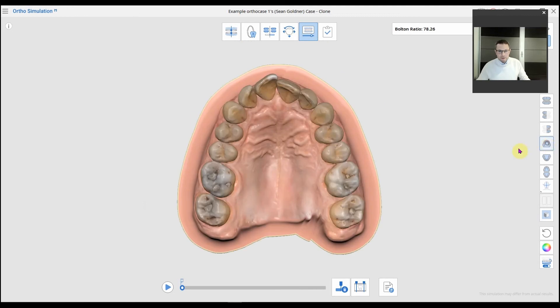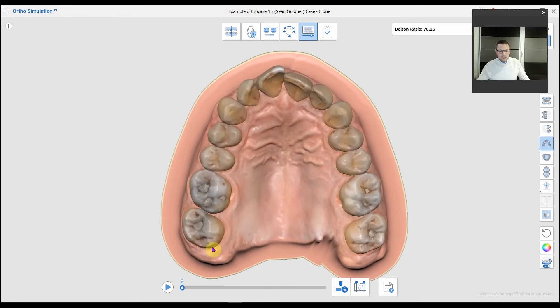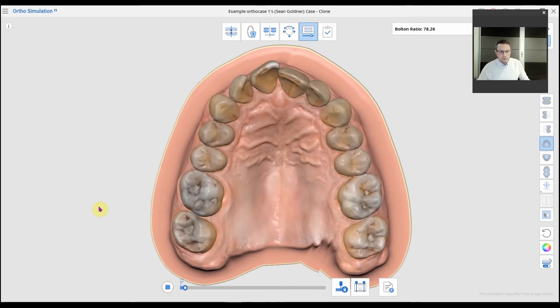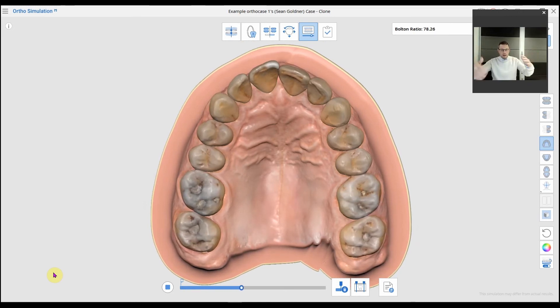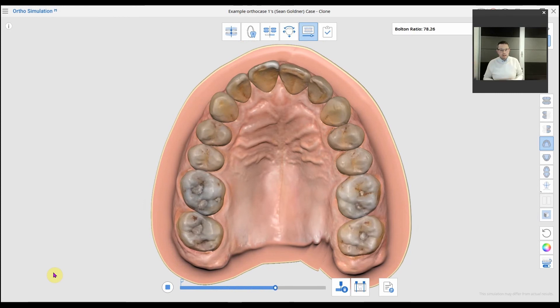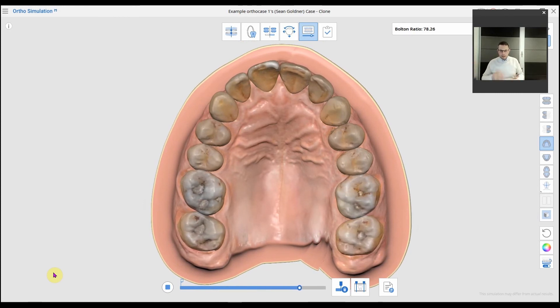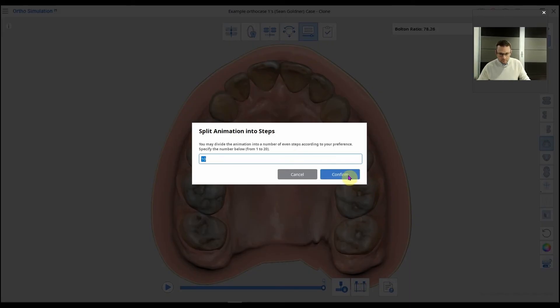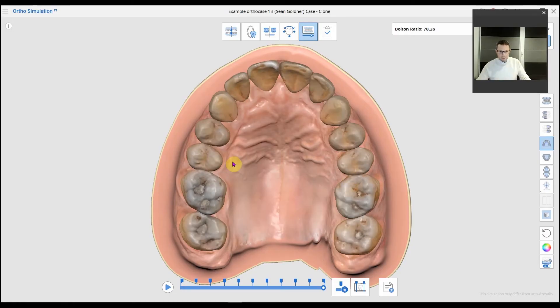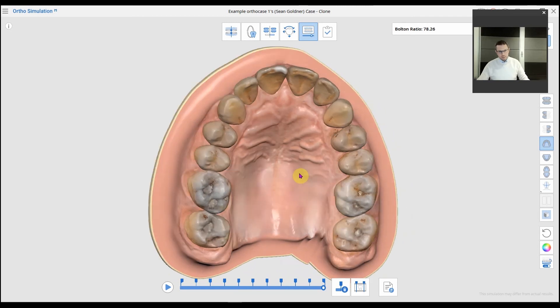You can look up into the maxilla and run the animation — it's about a 15-second animation and you'll see the teeth morphing into the new position. You can also look down into the mandible or from either side and see the teeth changing. It's a great tool.